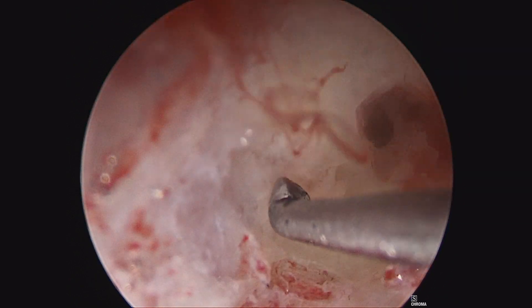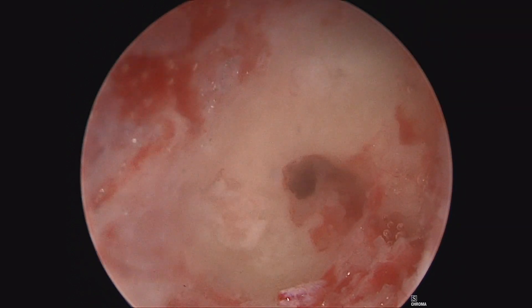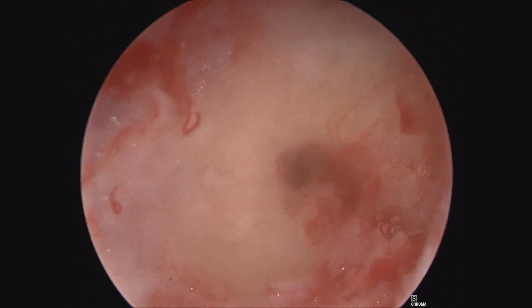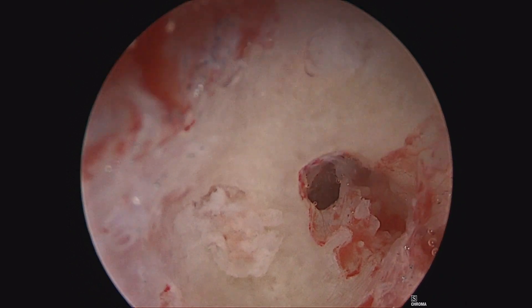This procedure is very similar to an arthroscopic surgery performed by an orthopedic surgeon for knee or shoulder treatment. The visualization is somewhat similar with the saline being irrigated. At this point of the procedure, both crura have been packed, and fascia and gelatin are placed over the repair and the procedure is completed.